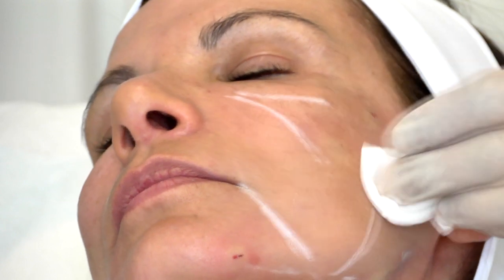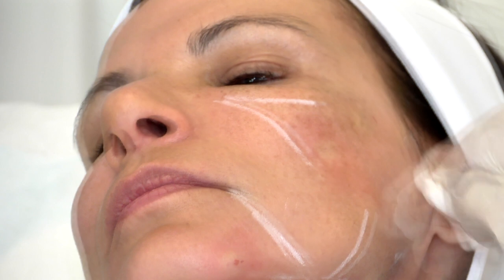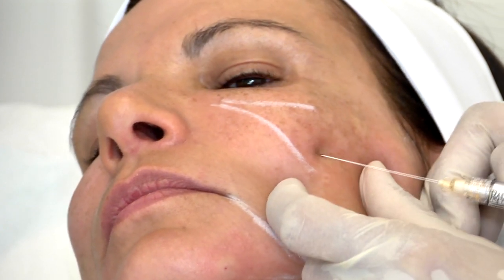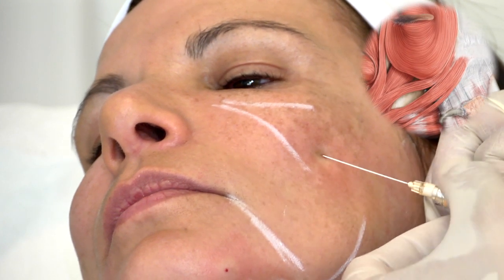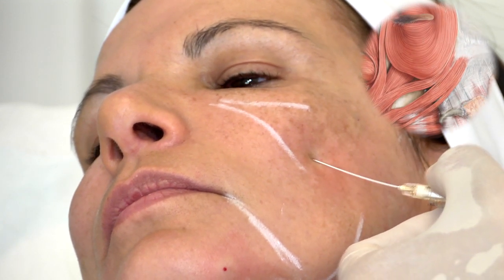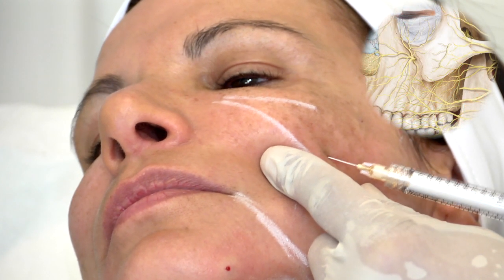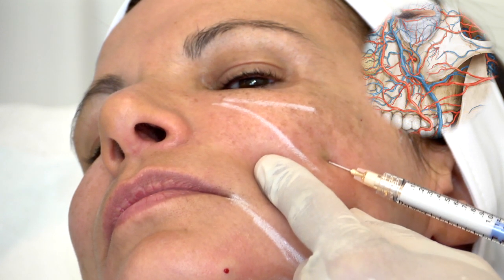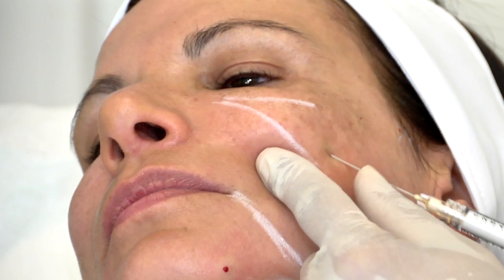After disinfecting, make a pre-hole with a needle to the dermic-hypodermic junction and insert the cannula parallel to the cutaneous plane in the desired injection plane. Make the retrotracing injection by removing the syringe to obtain a linear and homogeneous Radiesse deposit. Without removing the end of the cannula from the skin, change its direction and inject as many new lines as needed. The adjacent product lines are fanned out while limiting the number of injection points.